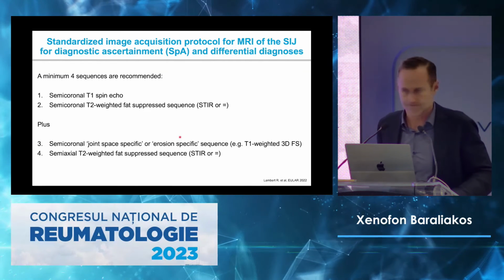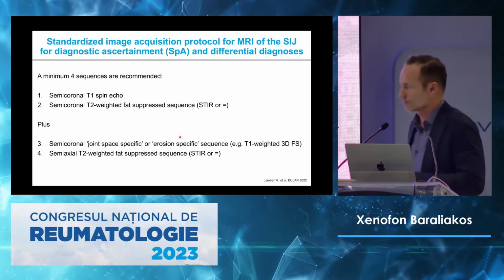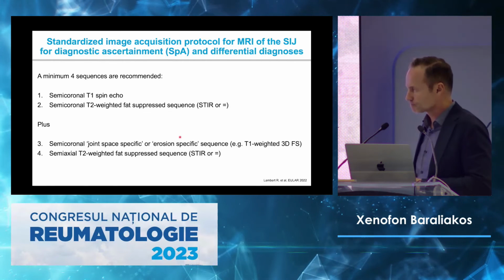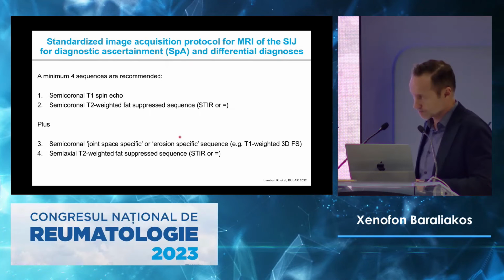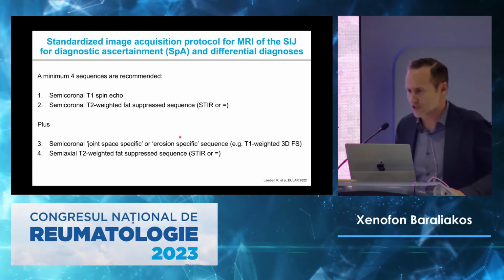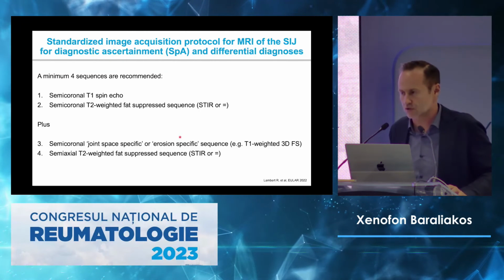I would say that if you go at the level of the sacroiliac joint, somehow you can explain that the fat is present, because you have the backfill that looks like fat, because it is fat. So you don't have ankylosis without the presence of the backfill before. Exactly. So we know that if you have backfill, you have much higher chances to get ankylosis. Why? Because that fat obviously creates osteoblastic activity.